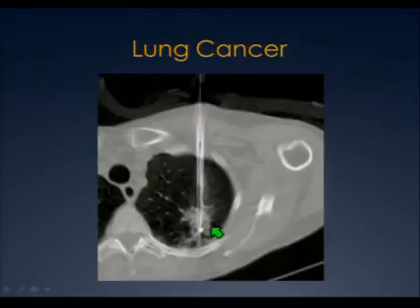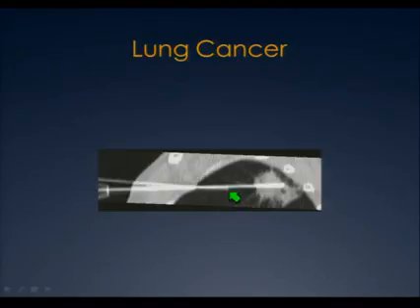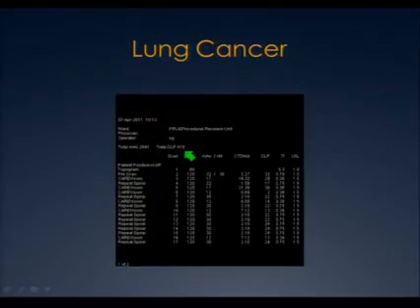It takes some time. Nice picture from the side. You can see where the biopsy needle was and now the ablation probe is. And we heat this tumor up and kill the tumor and then take it out and pray for no collapsed lung, no pneumothorax. Now, even that, I got away with a DLP of 418.